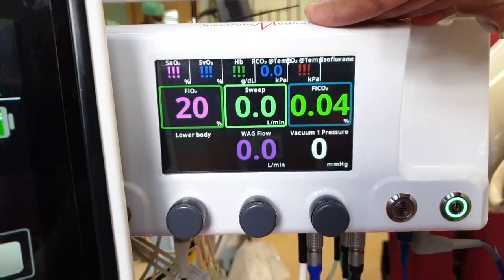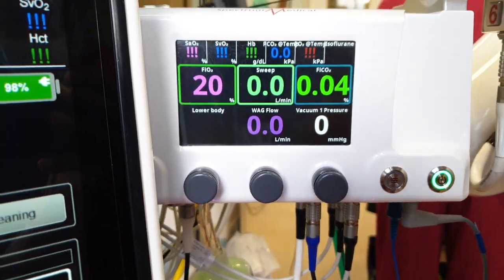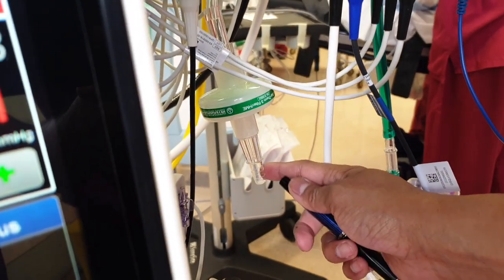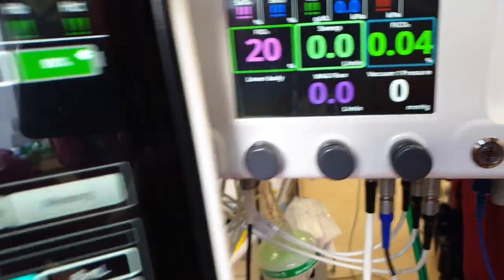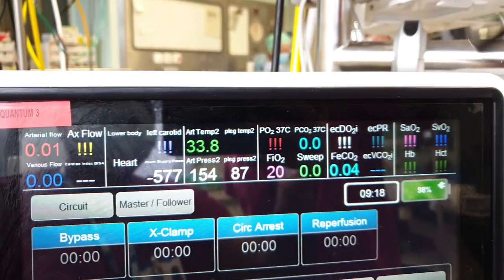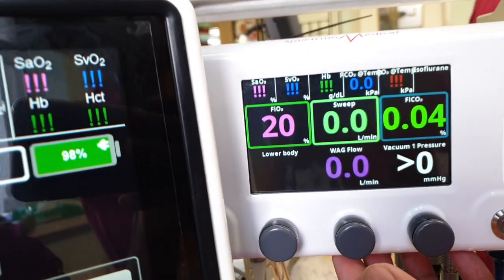Usually we need to measure the waste gas. So we have to connect the vacuum line here. Gas out here. You can measure the PO2, PCO2 accuracy during bypass. It's mandatory. Gas flow.